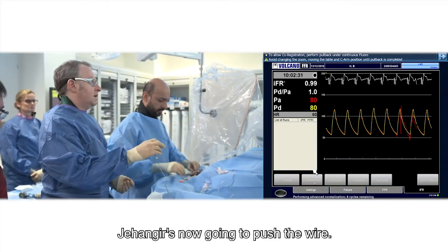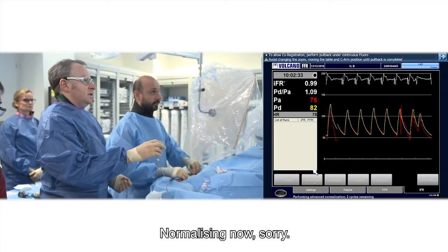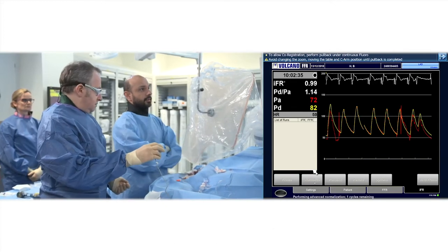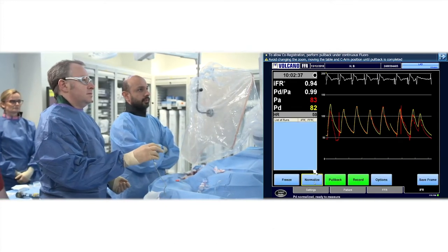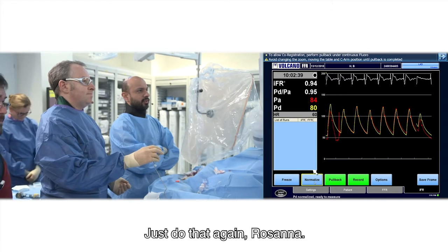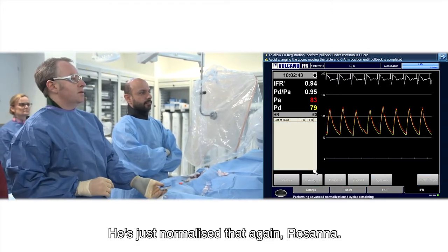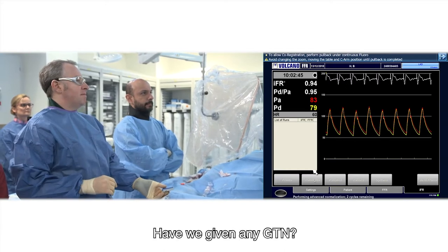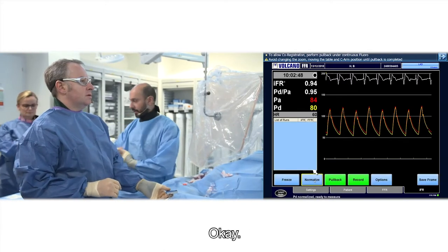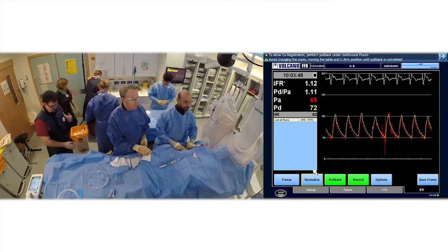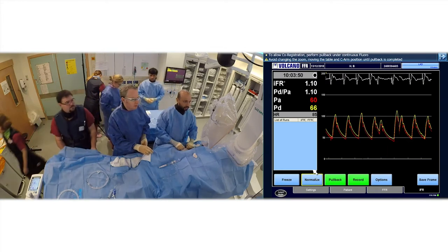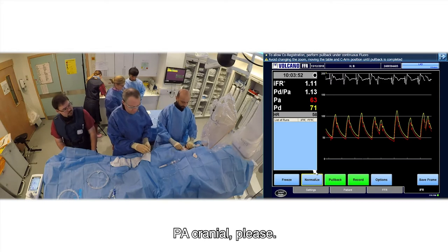Johanga is now going to push the wire. You're normalizing now. Sorry. Just do that again, Rosanna. Let's just normalize that again. Have we given any GTN? Not yet. We'll do that as soon as we advance the wire distally.